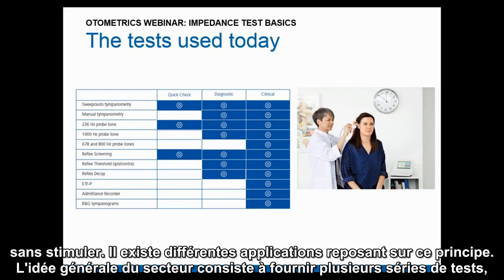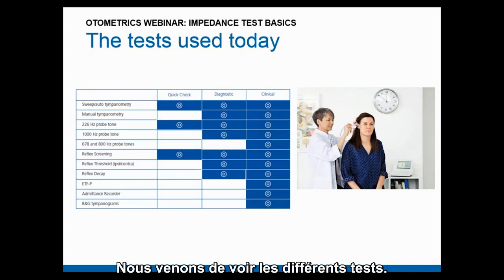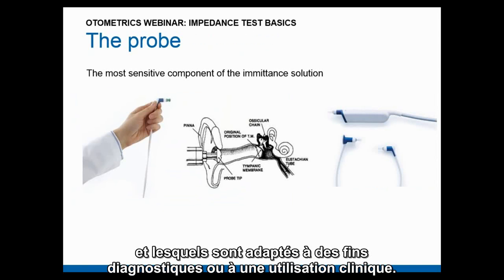But basically the idea from the industry is to provide different packages of tests, and with always a high-end segment providing as much as the company provides. So that's the idea about the different tests. But now you know actually what kind of tests you need in your clinical practice, and what is relevant for your diagnostic, or what is relevant for the hospital diagnostic or practice.